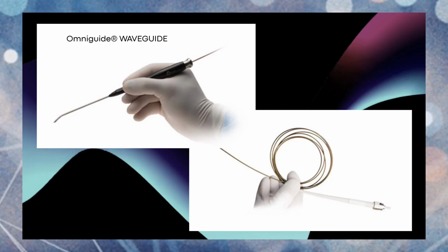Stapedotomy fiber use is very brief. You're using it very little, so you can get away with it. But if you're using it for, let's say, some kind of ablative procedure, laryngeal or other, or oral cavity, those fibers are going to tend to burn up more, and you're going to be using them at higher levels.